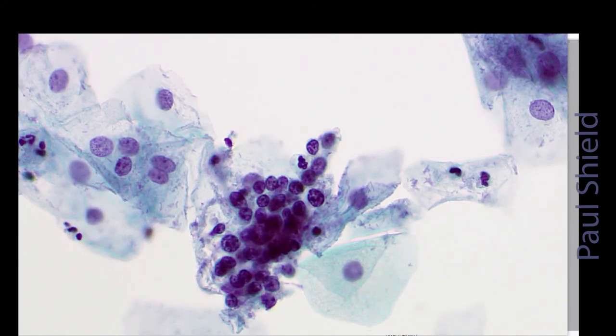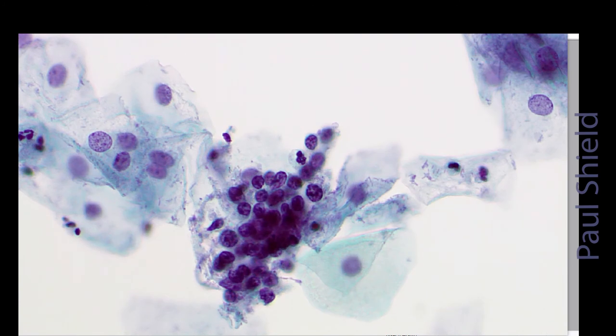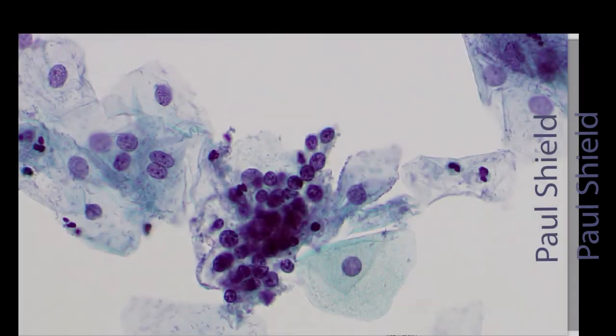This is a tricky mimic of high-grade cells. This is lymphocytes, so in follicular cervicitis. They look hyperchromatic and it's difficult to see a cell border on them, so it's hard to evaluate the NC ratio, but it appears to be quite high.